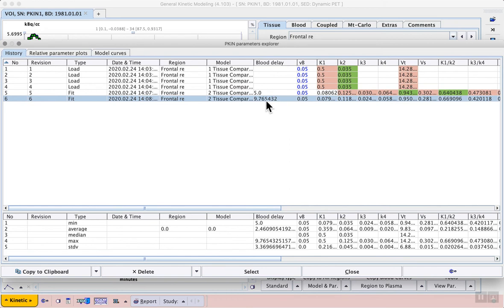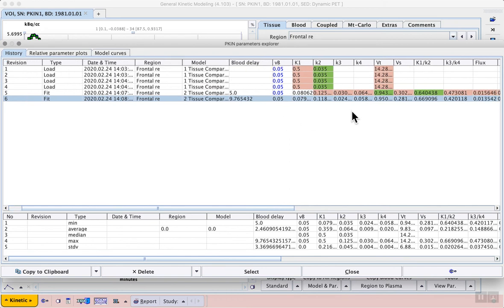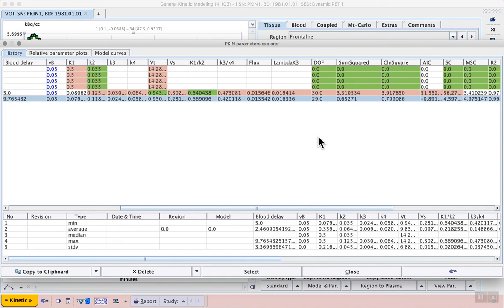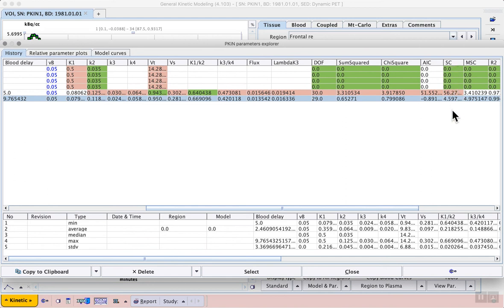Then in row 6 we see the updated fit after including the blood delay in the model. We scroll to the right and as well as seeing our parameters we can also see model fit parameters. For example the AIC column shows us the Akaike information criterion, the SC shows us the Schwarz criterion.